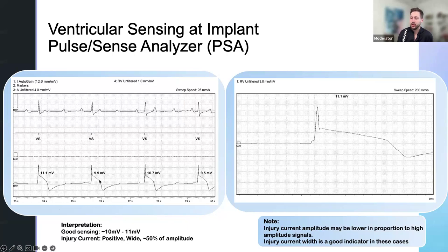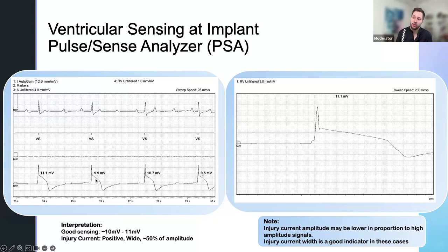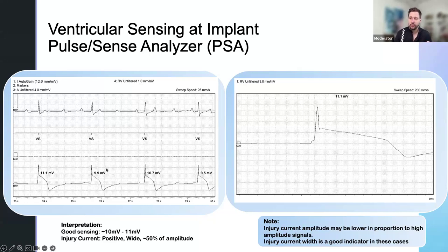The big thing I'm looking at here is injury current. We've talked about current of injury before — it's basically localized tissue damage. It manifests as ST segment elevation or QRS widening. Usually a STEMI is a red flag, a negative thing. But when you're connecting a lead with a PSA, you're looking for this injury current that indicates good tissue contact. You'll see an association of injury current and threshold. As injury current goes down, you'll see threshold start to improve, because these modern leads are all steroid eluting. As the steroid takes effect, you'll see injury come down and threshold improve.